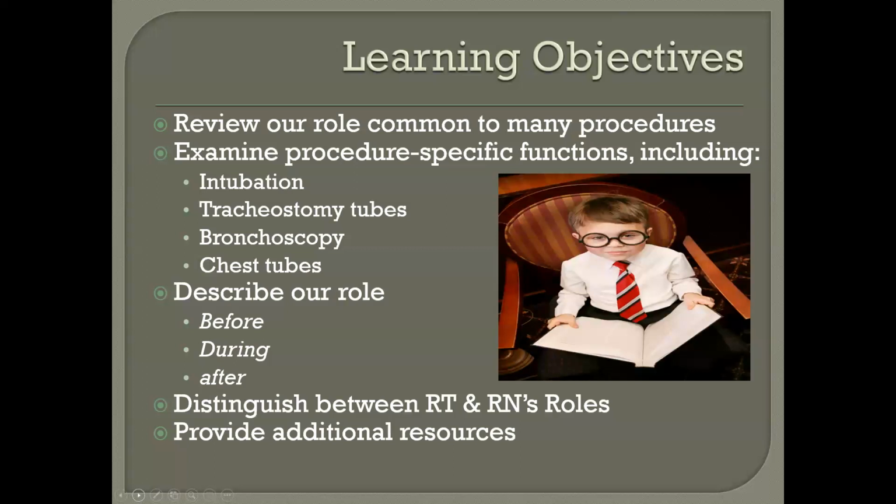In the case of a bronchoscopy that I'll cover in a little bit, you want to look at coag studies, particularly if the physician intends on maybe taking some tissue samples. A patient that has prolonged clotting times may be problematic for taking a tissue sample. Bleeding may persist, things along those lines.